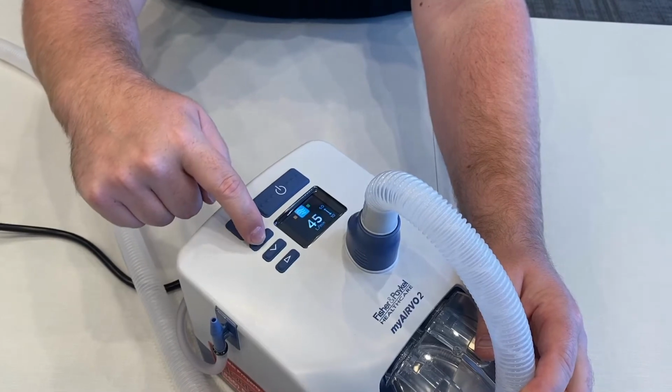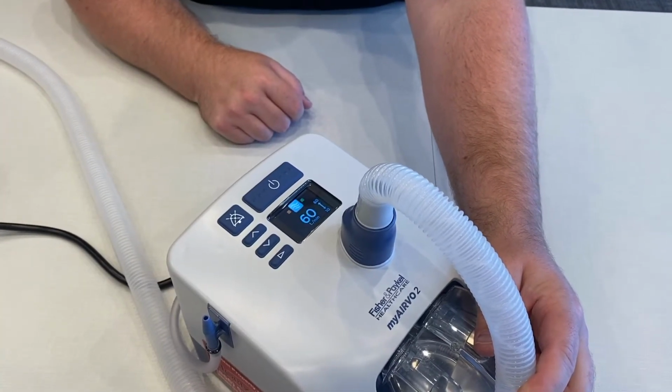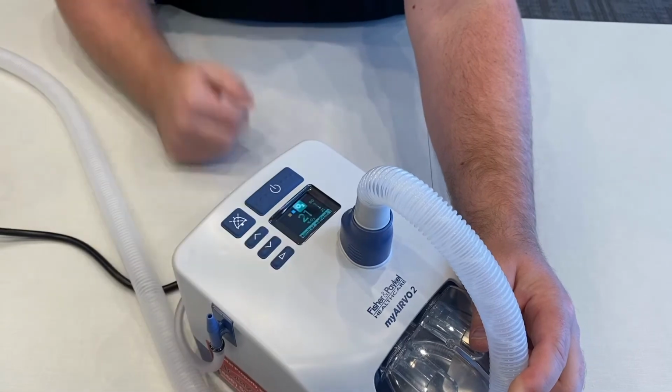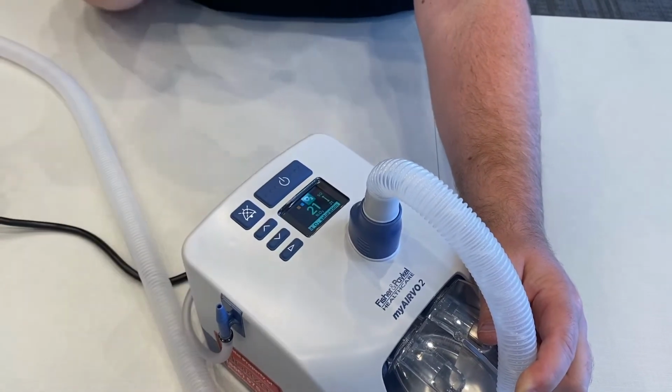It goes in increments of 5. So 60 is our maximum flow rate that we can provide. Once you've locked that into place, you hit play again, it shows that it's locked. And finally, in order to adjust our oxygen percentage, we have to insert an oxygen source.